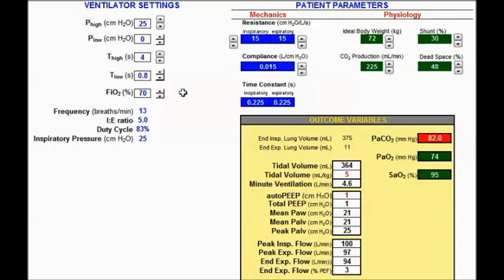So based on these T-low settings, these common basic settings that you use, the 0.2 to 0.8 range, when the patient's compliance remains 15, we are ventilating at a safe range. However, we notice we created some auto PEEP at the lower T-low settings.